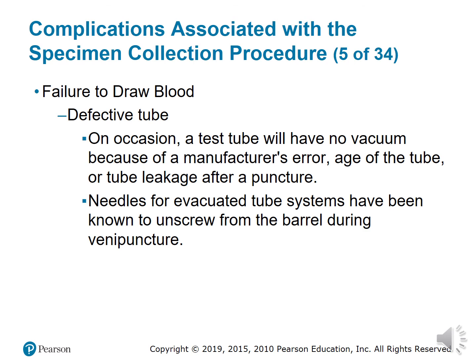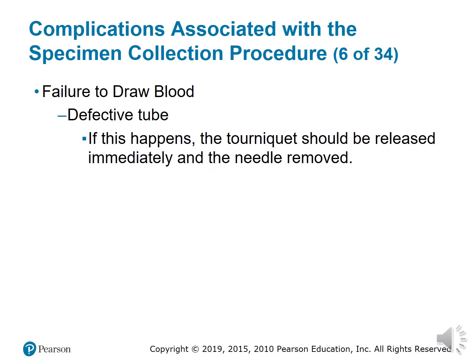Just further trying to elaborate on the importance of the steps. You want to make sure that you check the expiration date on your supplies, because these things play a part in the specimen collection process. They can have an adverse effect on the specimen as well as the patient. It's important that you follow the steps. I cannot stress that enough. If this happens, the tourniquet should be released immediately and the needle removed.